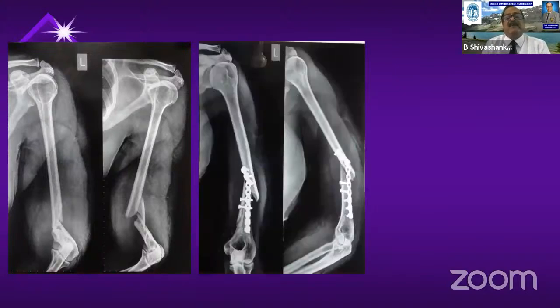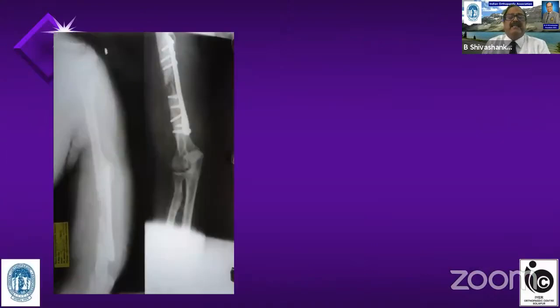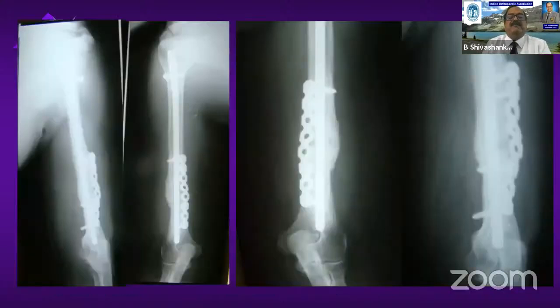This was not a properly done plating, and the plate failed. Philos was used, again that failed. This was the time I came to the picture, even that Philos had broken and the screws had broken. So what I did, a humerus nailing, augmentation plate, and bone grafting. So absolute stability, non-union requires absolute stability, which I gave by an augmentation plating.